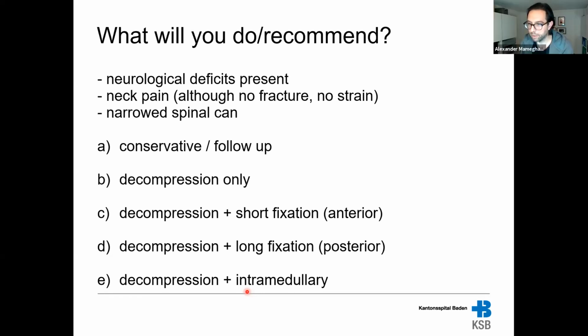Yes, but the level would not fit the neurological findings. It would be too low for any problems in the arms. So your clinical findings and the radiological findings don't match. Like this contrast enhancement on T2, this had no influence on the arms.